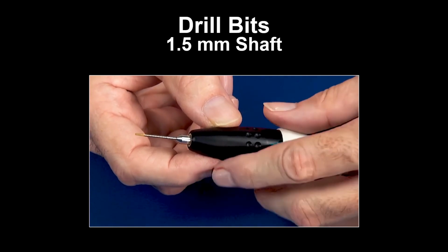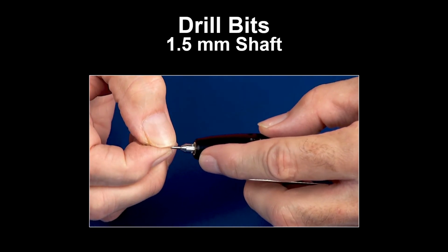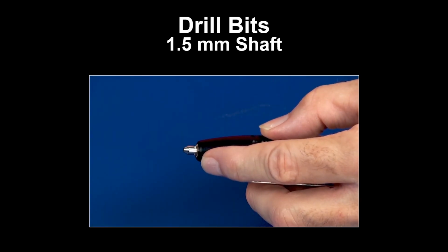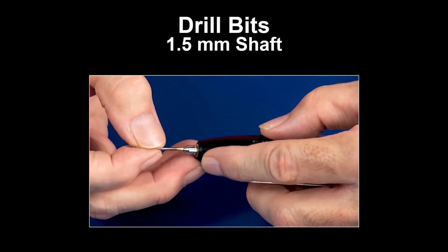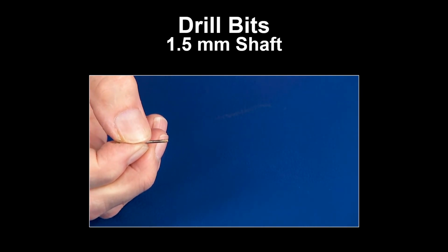Okay, then to extract the drill bit is simply to pull with enough force to remove the wedge. And the drill, intentionally, if bogged down, can be removed by pulling the drill away from the drill bit.